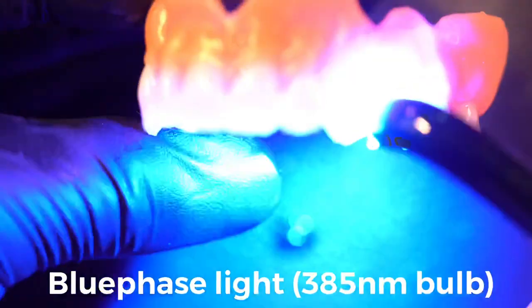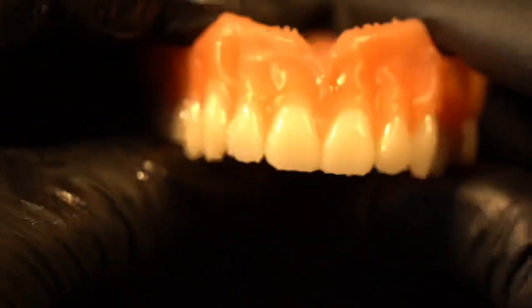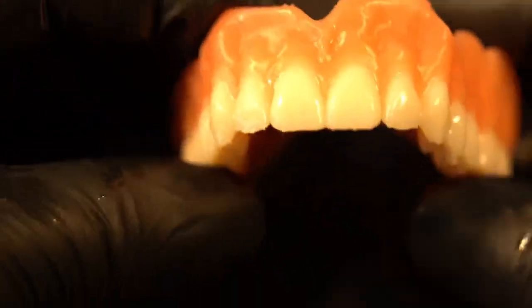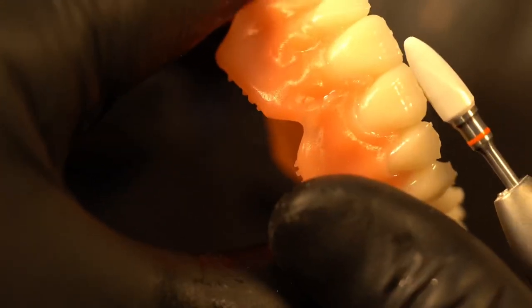Now I'm going to use a Blue Phase power light by Ivoclar. This light is special because it has a 385 nanometer bulb, which is the peak spectrum for curing photopolymers. I'm going to cure each tooth for 10 seconds — this is extremely sped up so we don't waste time — but 10 seconds on each tooth gives a very profound cure. Remember, I have not finalized the cure of the whole product in the Otoflash yet.